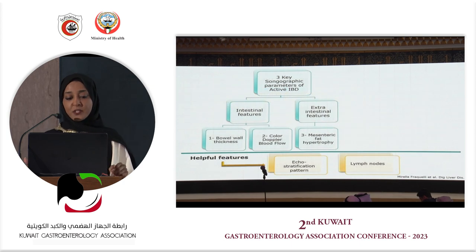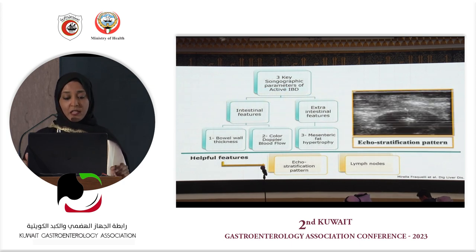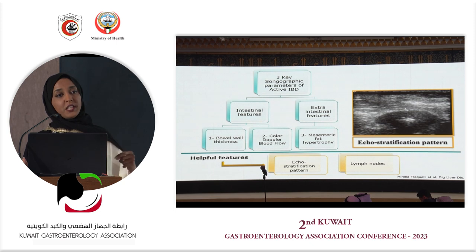One more thing, as I mentioned, some helpful measures. The echostratification goes with how bad the inflammation is. So if we lose the stratification, that means we really have a good sort of transmural inflammation.